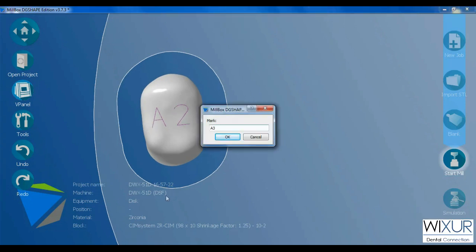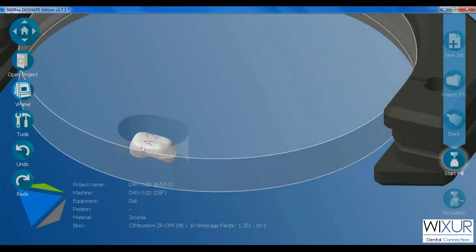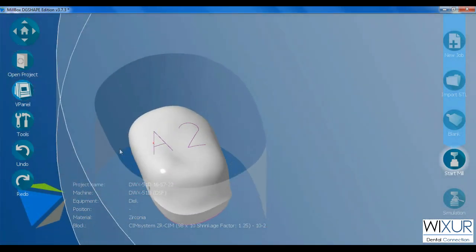The marks follow an order by default — every time you open the window, it moves to the next mark. After milling, you will see this A2 engraved on the crown.